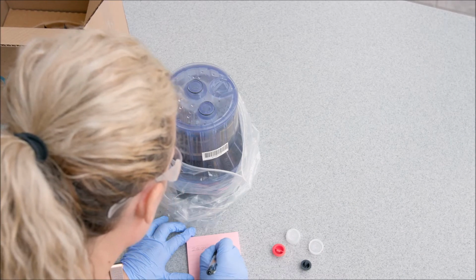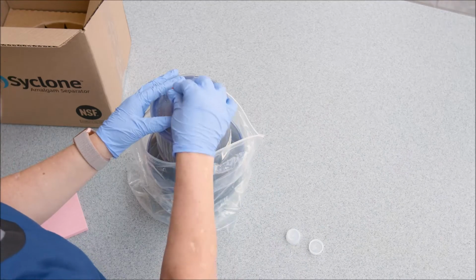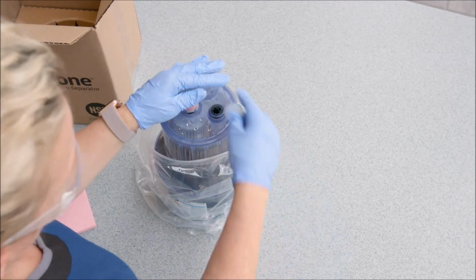The full canister should be packed and shipped as soon as possible after the replacement is installed. Securely pack the full canister. Push the corresponding plugs into the two top fittings of the used canister and seal with the provided caps.